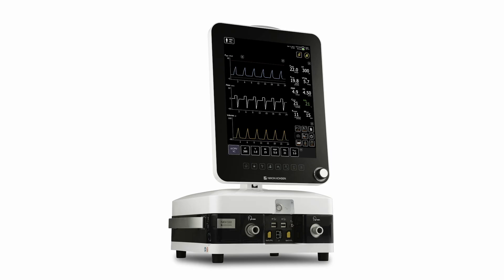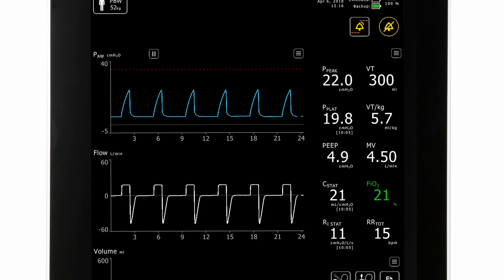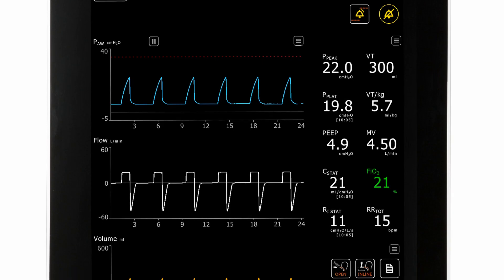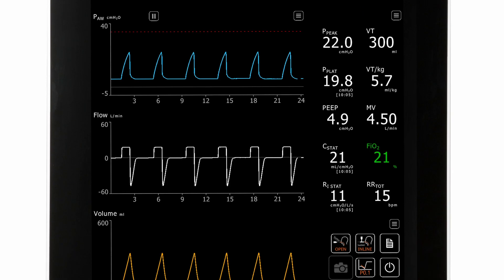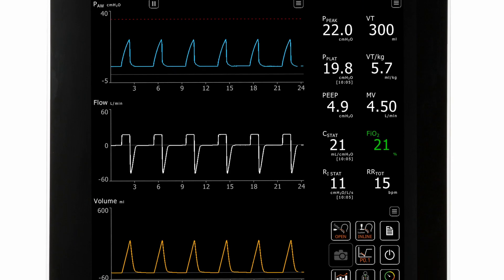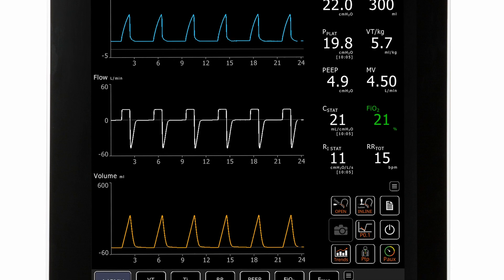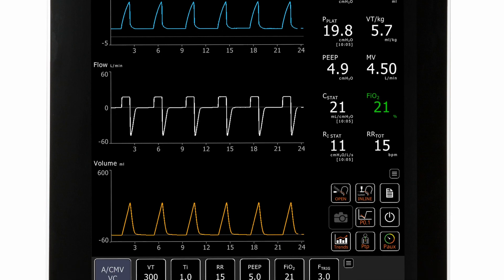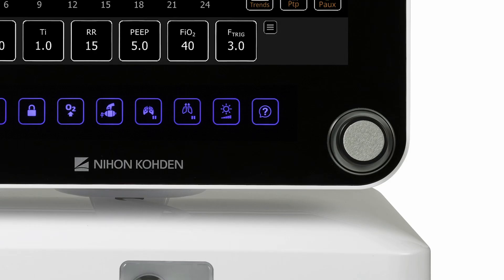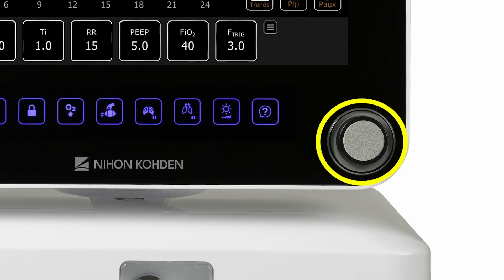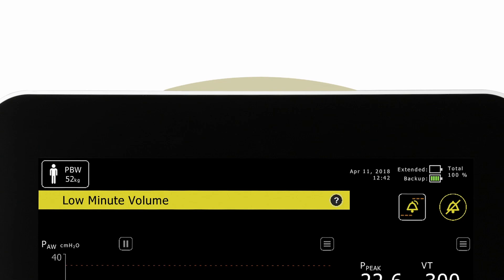The GUI is a 17-inch touchscreen powered by the breath delivery unit. Clinicians interact with the GUI both through the touch interface and the encoder knob. There is a large alarm LED at the top of the GUI that provides 360-degree visibility for clinicians.